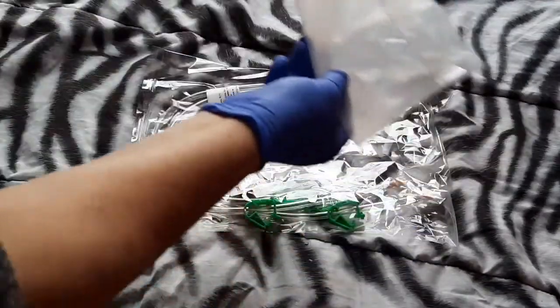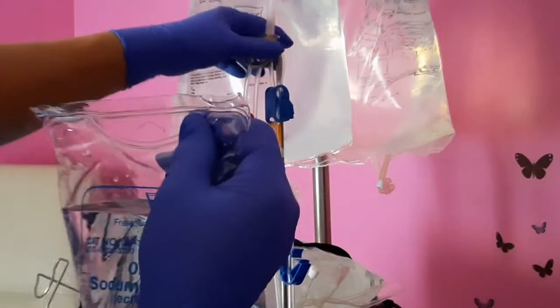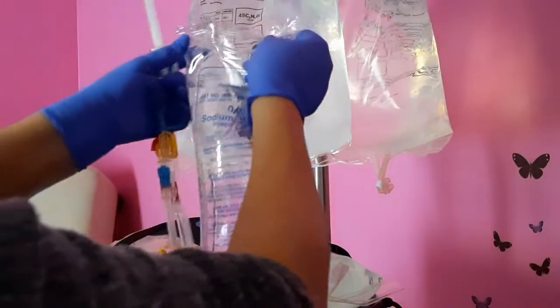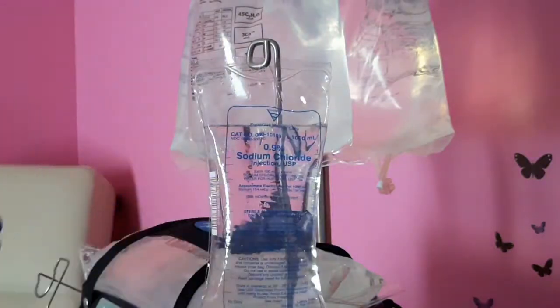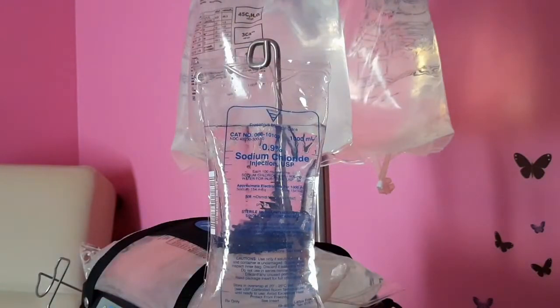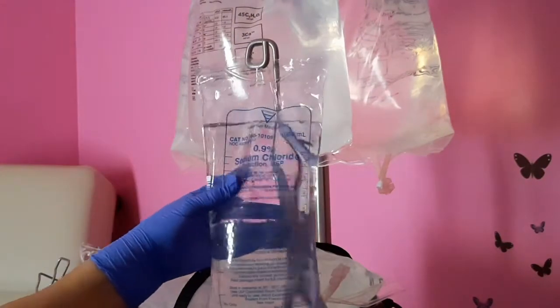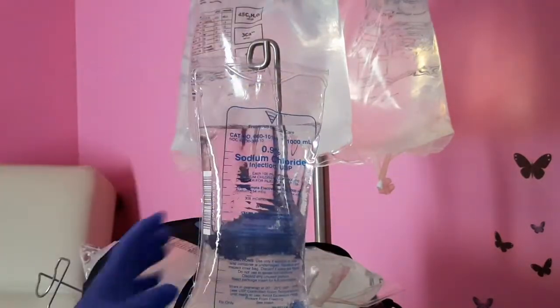Alright, take your bag out. Make sure there aren't any leaks anywhere. Okay, this one seems to be good. Then we're gonna go hang this up on the drip line. Okay, so we're at the drip line. We're going to take the spike. We're going to hang our saline bag with the writing facing you so that you can always see what it is. Just in case you ever overlook it and you happen to be putting it together and say, oh, wait a minute, that's not sodium chloride. You know what I mean? So it's always a good idea to have the writing facing you.